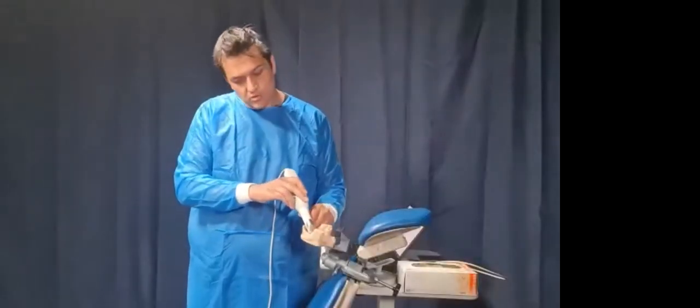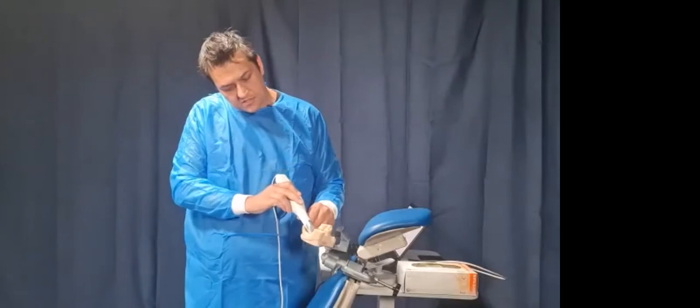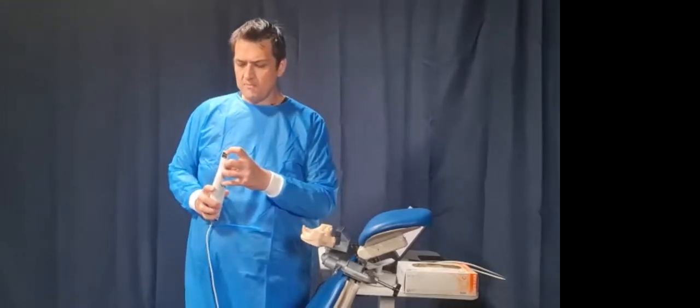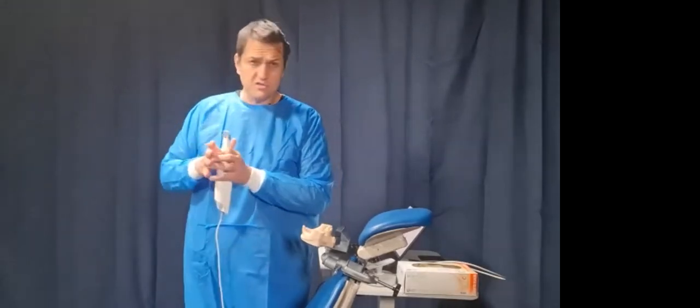Now, hamular notches, again, is very difficult, so you need to really angle your scanner so you can follow that retromolar pad up the hill. And again, that's quite tricky sometimes. So you're using the tip of your scanner right there. This is the part right here that I use, and I use it to flatten out the mucosa and then image as we go.